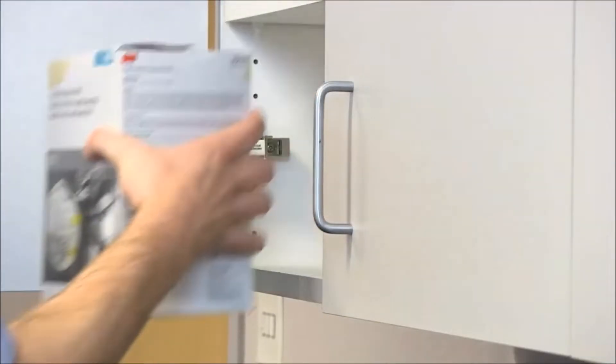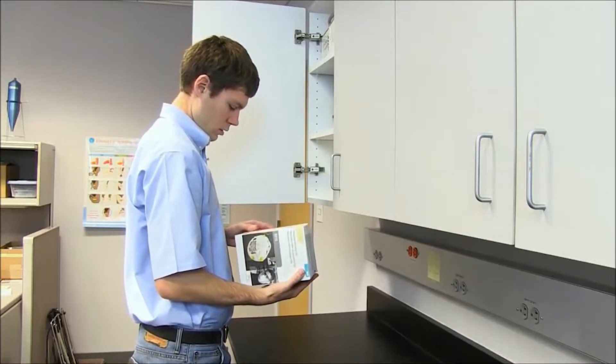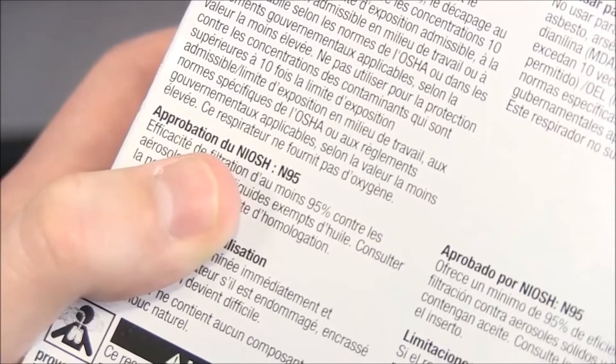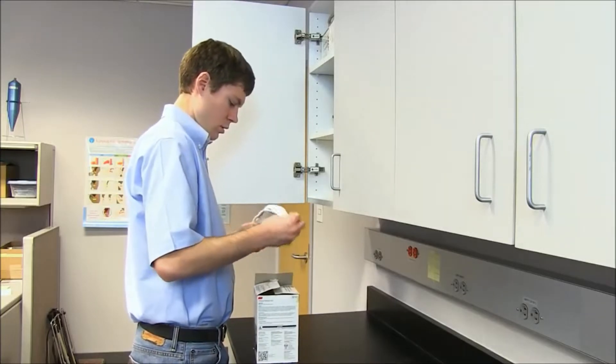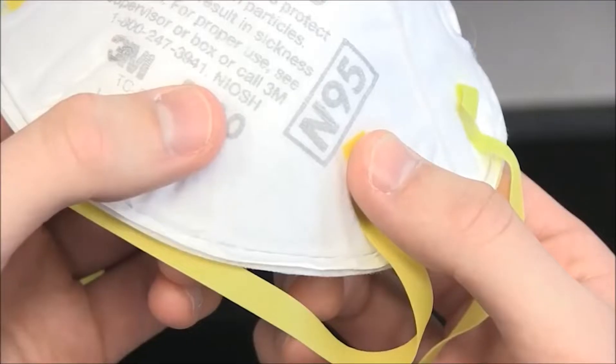Check the respirator manufacturer's package or the respirator itself to make sure N95 and NIOSH are printed on the front. If you don't find these listed, the respirator may not provide the level of protection you need.